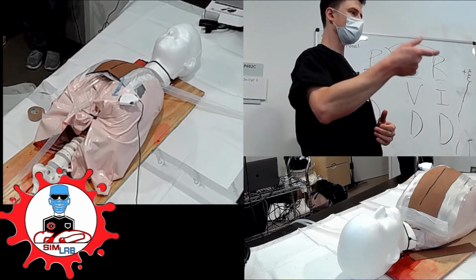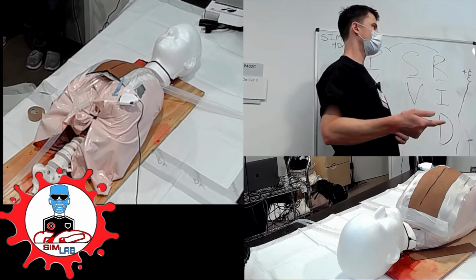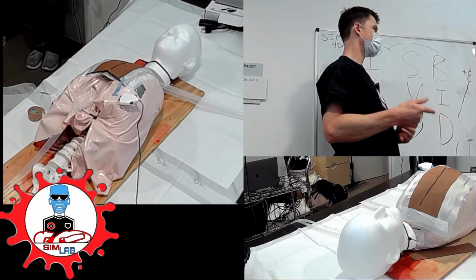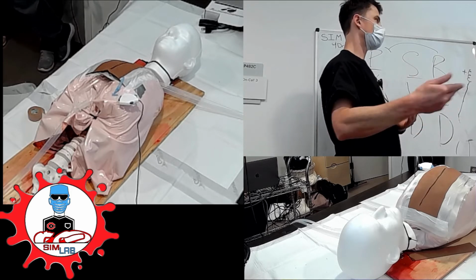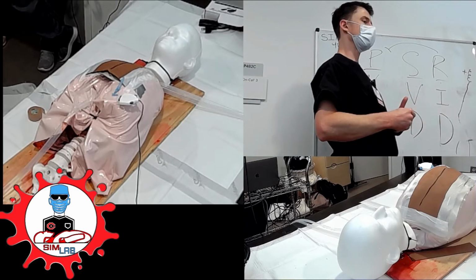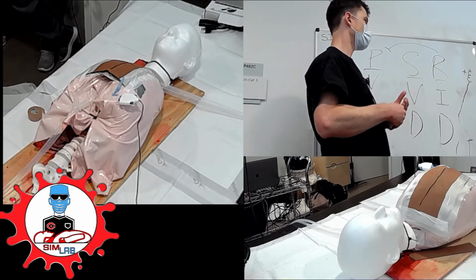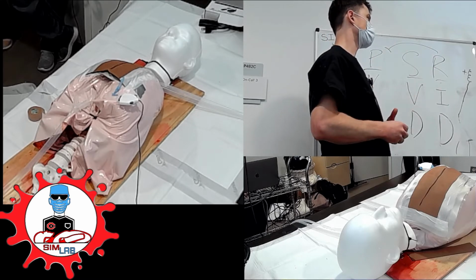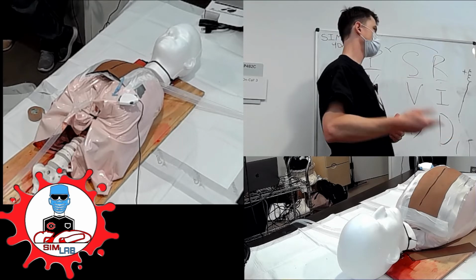The difference that Tom pointed out, though, is that unlike ACLS, for any patient where we would not typically try to pace because it complicates the algorithm, is unlikely to work, et cetera, these patients have reasons where they lose conduction completely, and so restoring conduction may bring back a perfectly fine perfusing rhythm very quickly without disrupting your surgical site in the immediate post-op period.